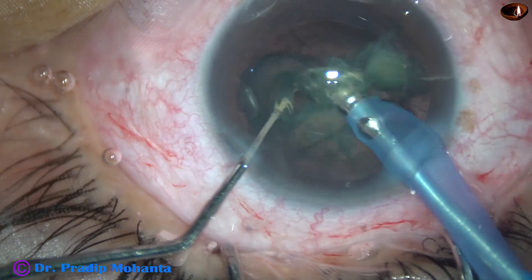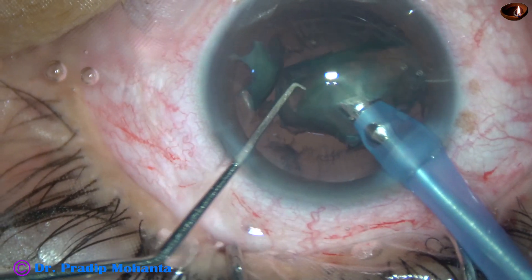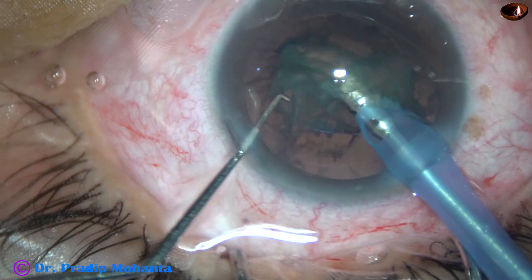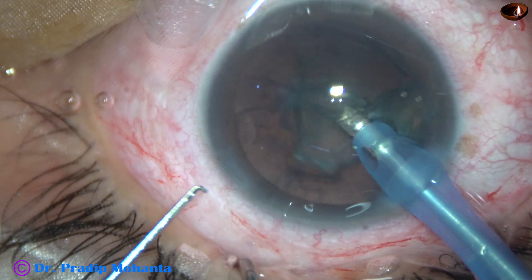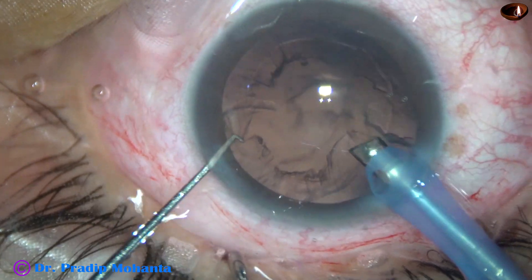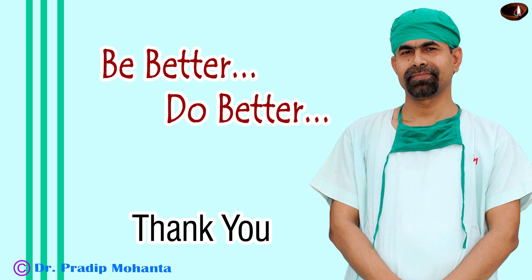The pre-chopped nuclear pieces are emulsified very easily. Come to the other hemi-nucleus, divide it into two pieces by the phaco probe itself and emulsify. This is another beautiful way of managing the nucleus. Both ways are good, but if we learn both we become more confident in surgeries. Thank you very much — hope this video helps you develop your surgical skills.